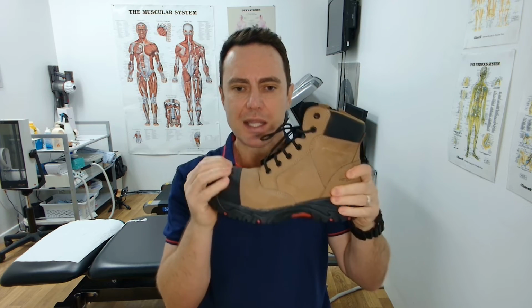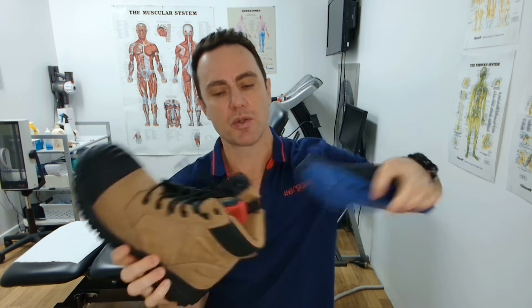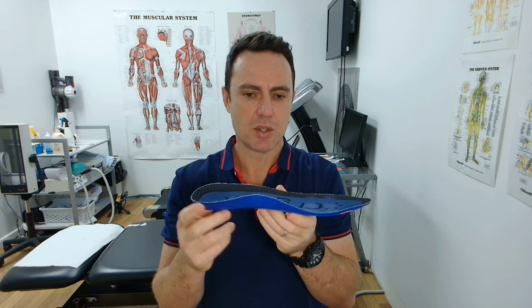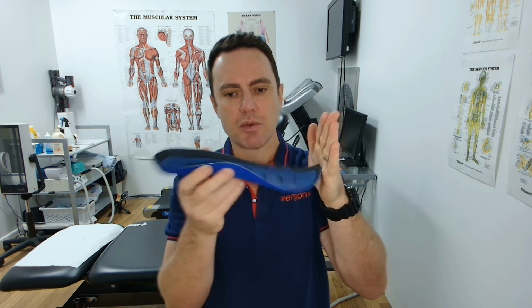But if you're selecting another work boot to fit a custom-made orthotic insole, one of the best features you can have is to make sure there's room to accommodate the orthotic insole. In this work boot, we've got this long, high, non-custom arch support. It's a really high, supportive, cushioned orthotic insole. So your podiatrist can remove this and be confident that there's enough room in the forefoot to fit their full-length orthotic, so it'll sit nicely in the boot and won't rattle around.